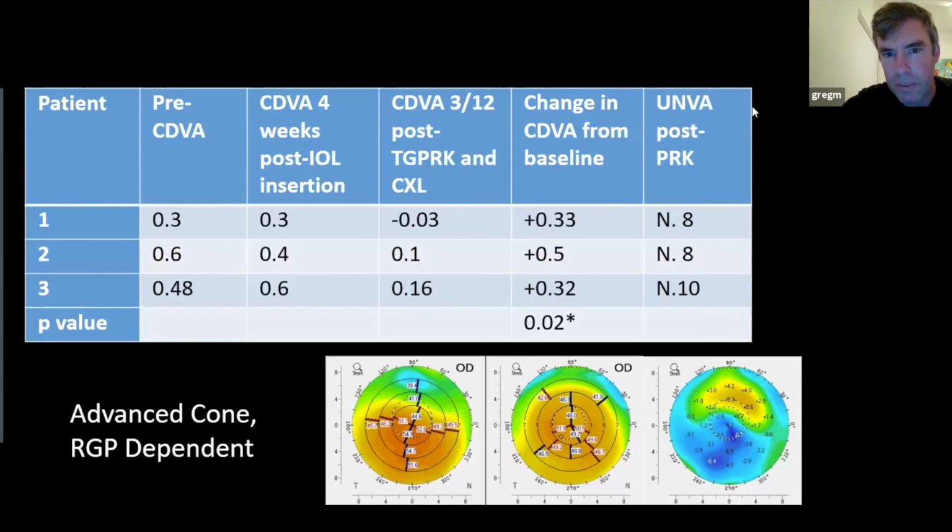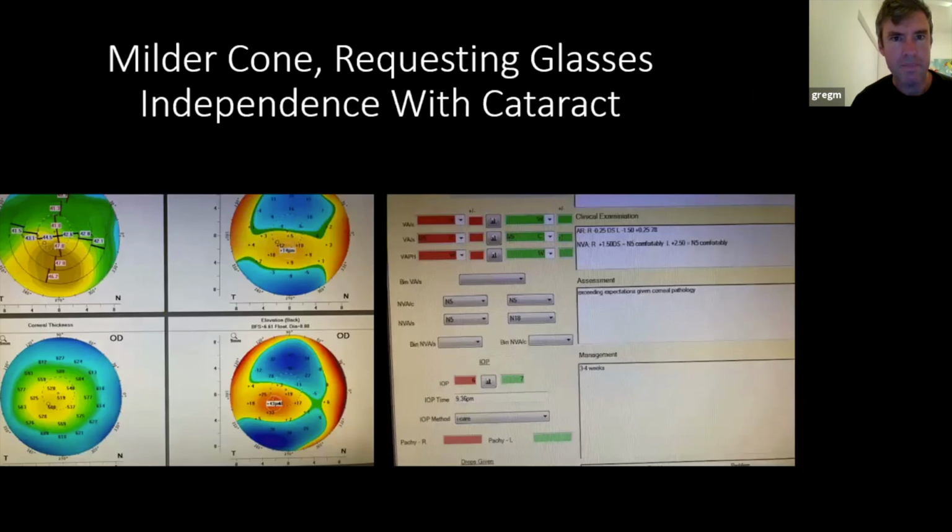It reduced the amount that we needed to take. And then with that second step, really quite impressive visual results were able to be obtained. All of these patients are 6/7.5 or 6/6.5 in glasses now, having come on that journey from rigid lens dependence. So I found it to be a very useful addition to that algorithm.